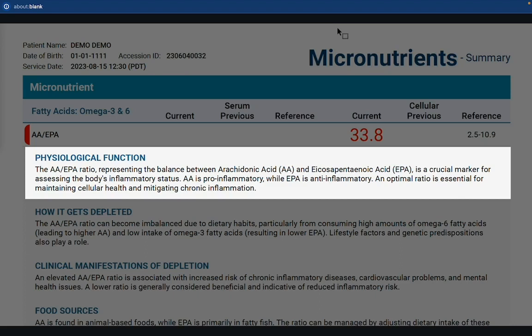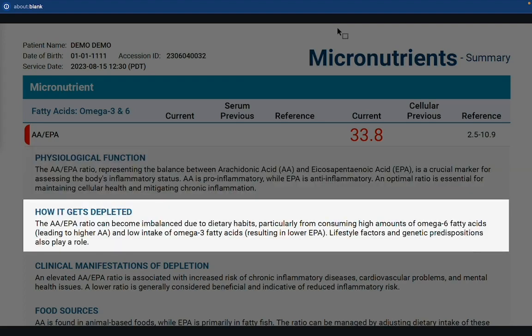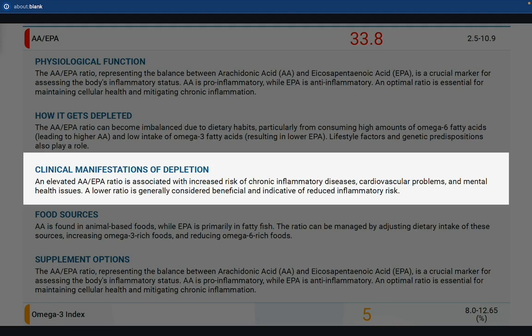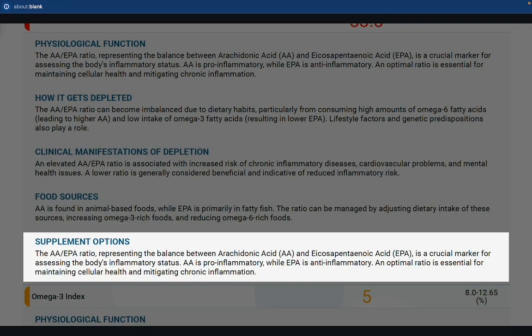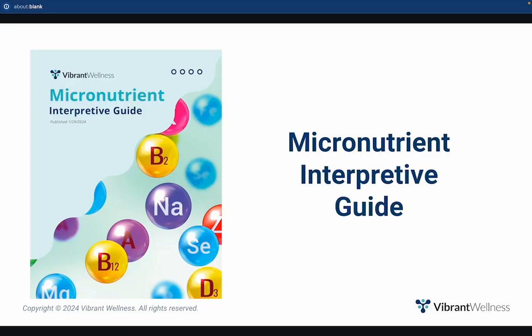If you want to learn more about nutrient levels outside the reference range, simply scroll back to the report summary to read the interpretive comment, which includes physiological function, how the nutrient gets depleted, clinical manifestations of depletion, food sources, and supplement options.